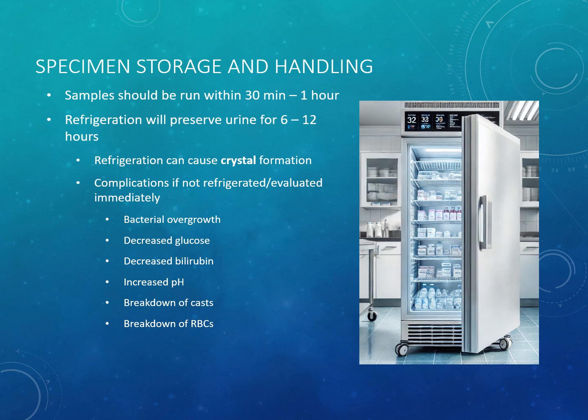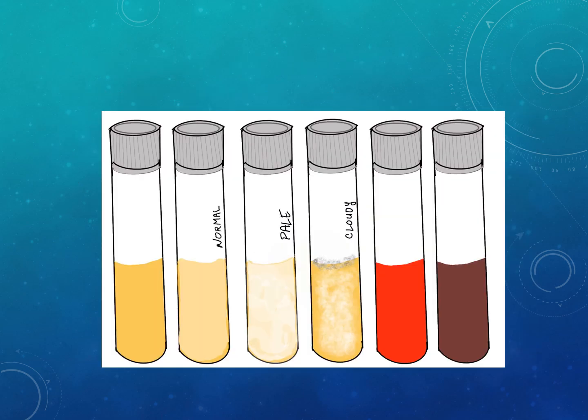running it. Okay, so the first part of a complete urinalysis is the physical portion, and we're going to talk about that now.